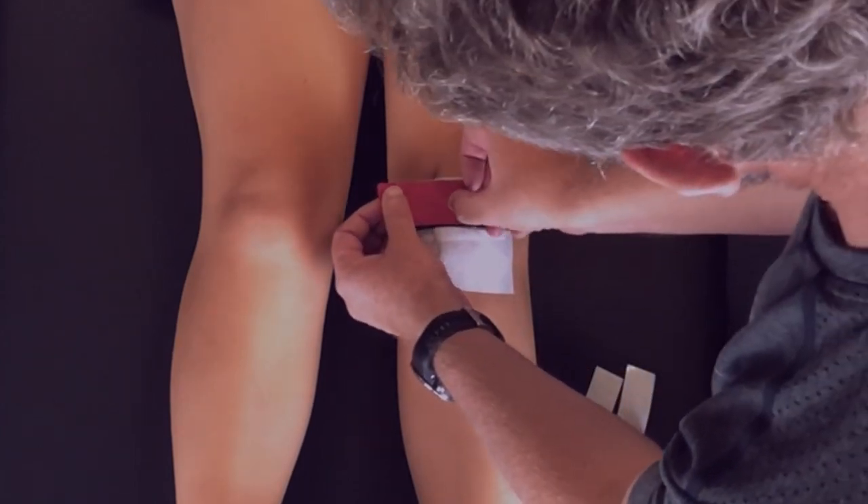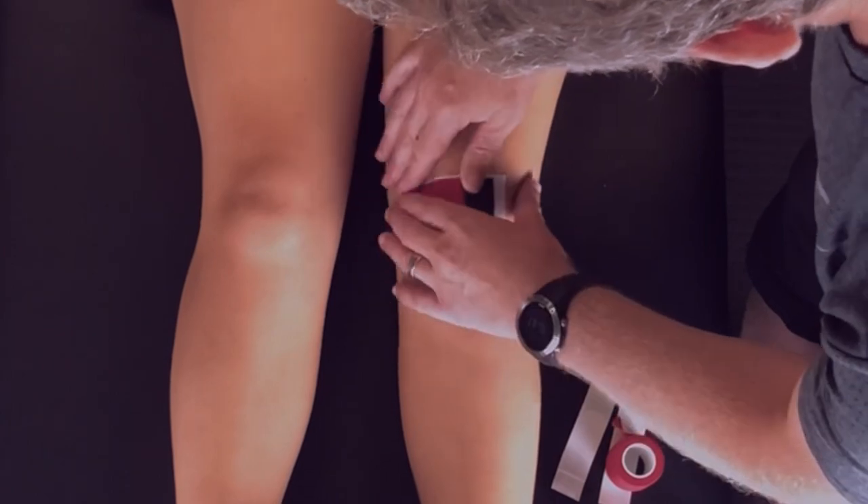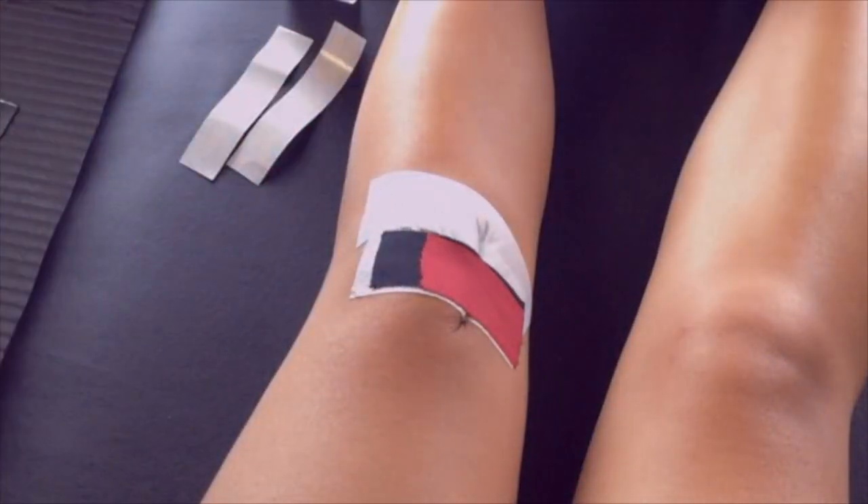Start the second piece of tape halfway across the kneecap and then follow the lines of the first tape. This will produce a tilting of the kneecap.